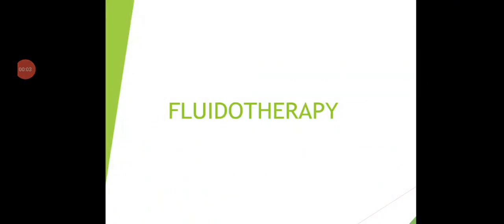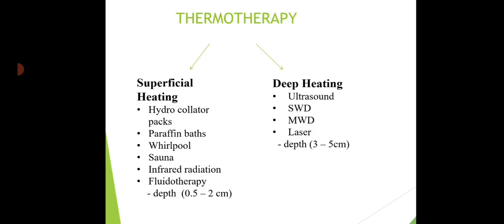Today our topic is fluidotherapy. So let's begin with the topic now. Here we are using the temperature as our main aspect to treat. There are superficial heating modalities and the deep heating modalities which come under thermotherapy. So let's see a few examples of superficial heating modalities.